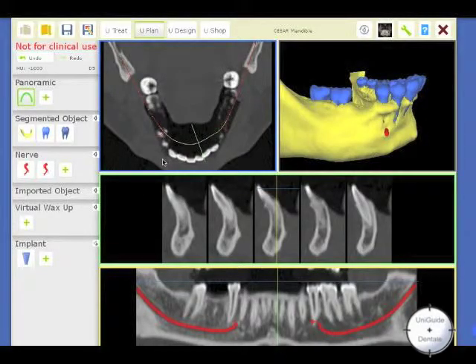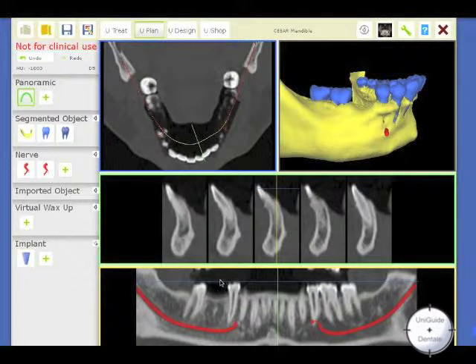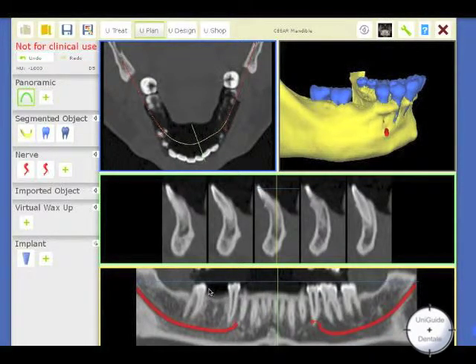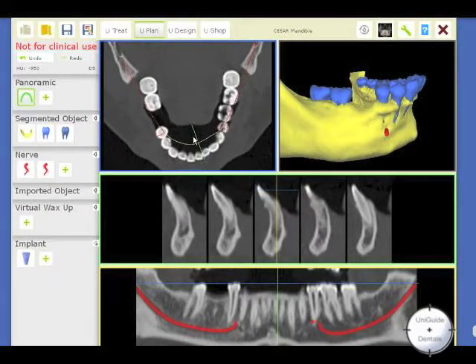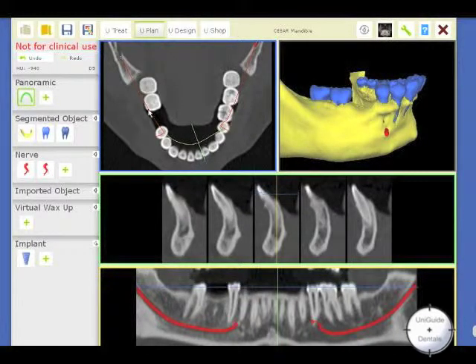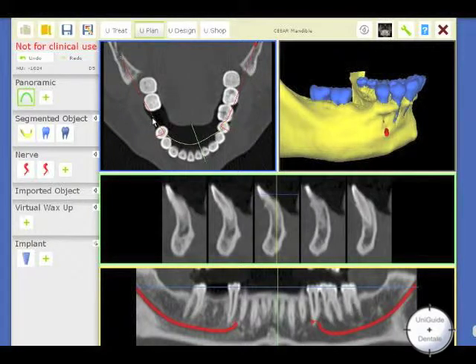I am going to show you in AccuGuide a very easy way to fabricate a virtual wax-up. We have one missing tooth here and we want to replace this missing tooth. We want to make a wax-up so that the implant will emerge in the center of the tooth.